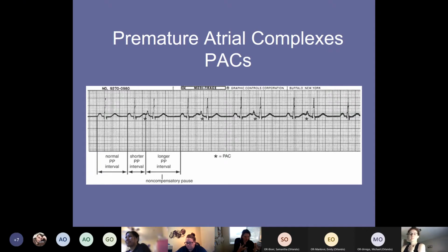Features are specific characteristics within a strip that are not naming the whole strip. So we never have a strip that's called PACs. We have a rhythm with PACs. Okay, PACs, premature atrial complexes, are a feature. Premature junctional complexes, feature. Premature ventricular complexes, feature. Those are never rhythms on their own. It's a very commonly missed item right there. We have to see what the underlying strip is.